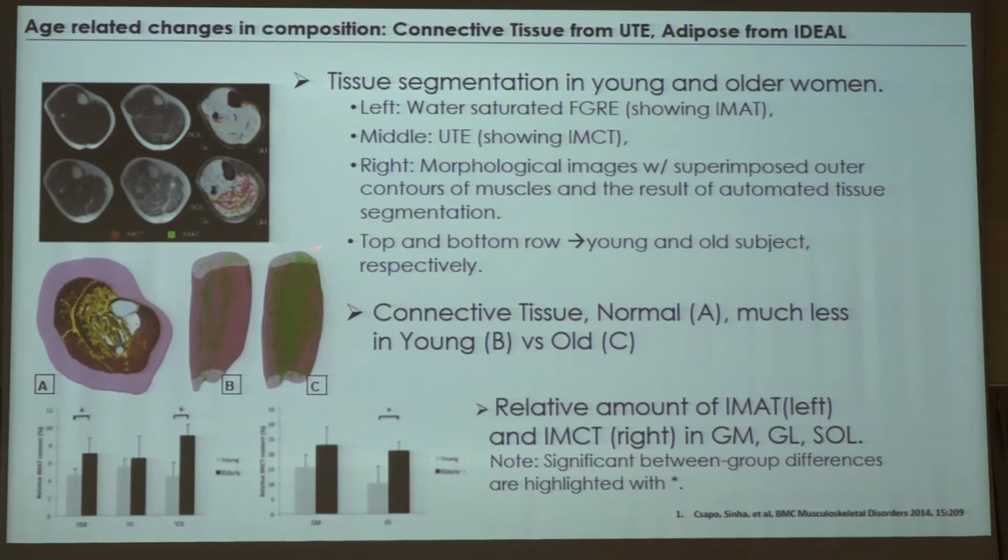which enables one to look at semi-solid substances such as cartilage and so on. What you see from this probe is that there's a lot more of this green, which indicates the extracellular matrix elements, and it's much more in the senior subject compared with the younger one.